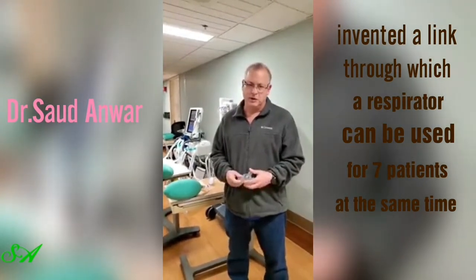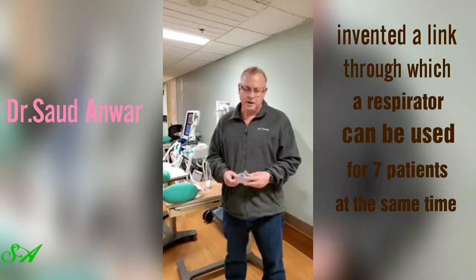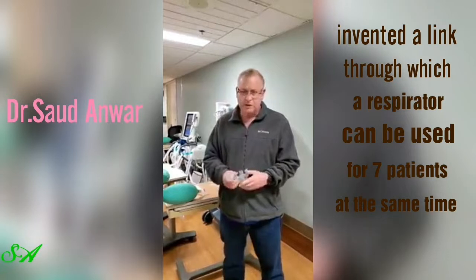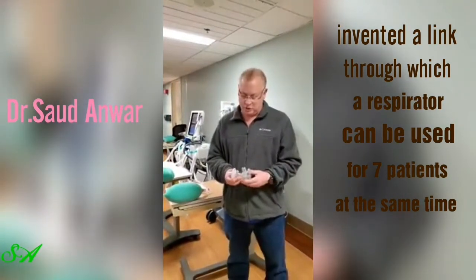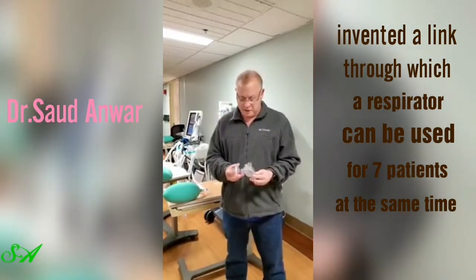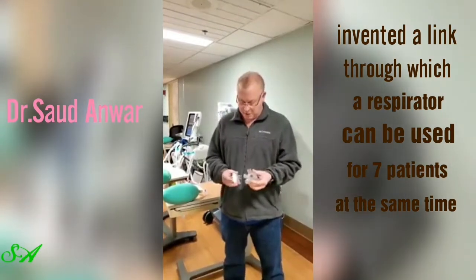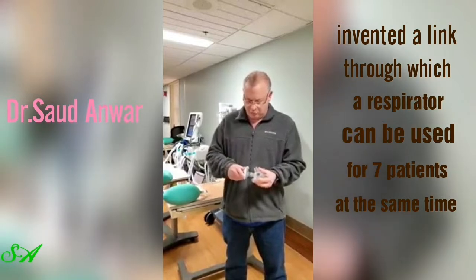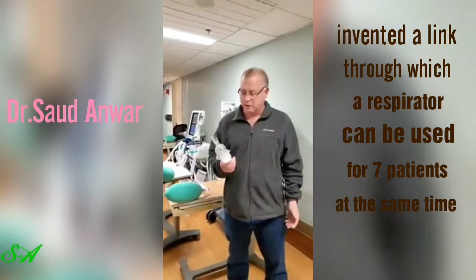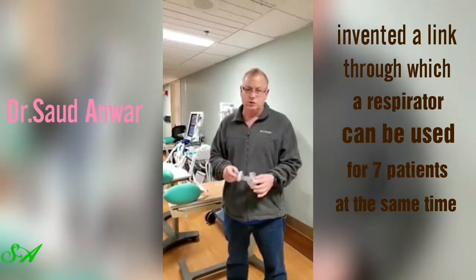First thing I got was a hose from the anesthesiologist, and we did our first trials yesterday. Came out with mixed reviews. We had problems with the ventilators interfering. So I redesigned it yesterday morning. I sent the files to Kevin Dyer at Interpro Models. He 3D printed this CAD model overnight and supplied it this morning. It's very simple. It has 4 filters with a coupling that goes directly to the ventilator. There are no issues with interference between the round filters or the square ones.